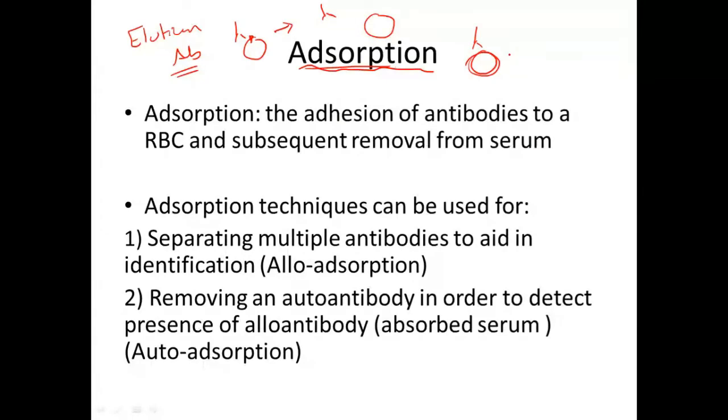solve some problem. Okay. طيب, إذن الابزوربشن والإليوشن تعتبر quite يعني advanced technique, and it's not routine. مو شيء روتين إنك زي شغل كل يوم زي ال ABO typing والدات screening, identification. No, we have to do it at certain conditions only. So however, it's very important because sometimes, as we will see now, you may encounter a problem, so we have to know how to solve these problems.